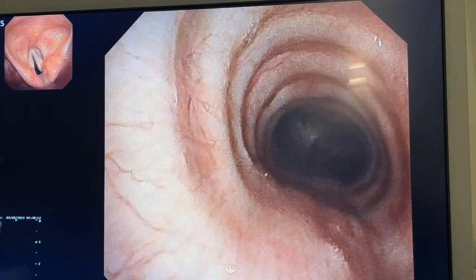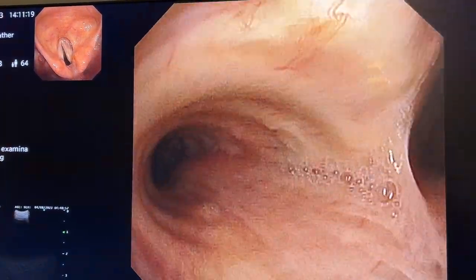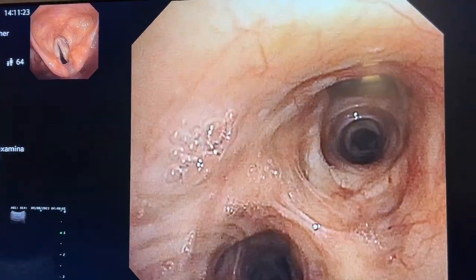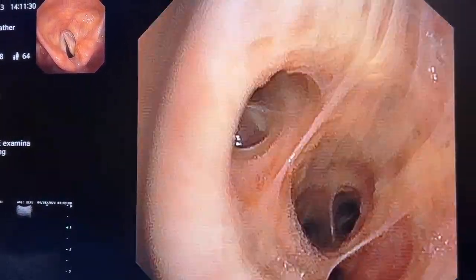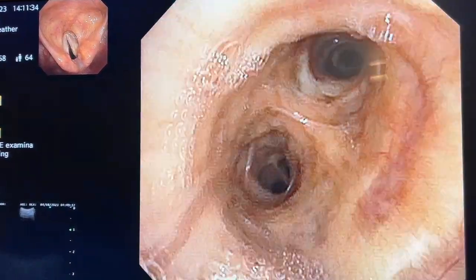This is the bronchoscopic view from the trachea. Firstly, have a look down the left lung, which the airways should be normal, so you can see a normal left main bronchus, left upper lobe here, left upper lobe proper, the lingula, and the left lower lobe are all nice and patent, normal looking airways.